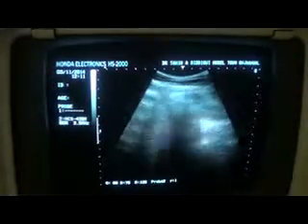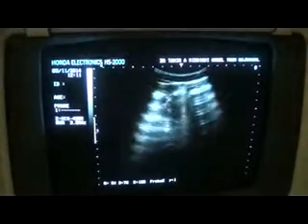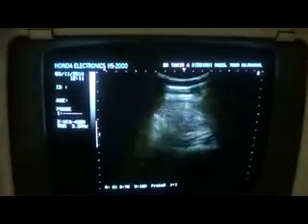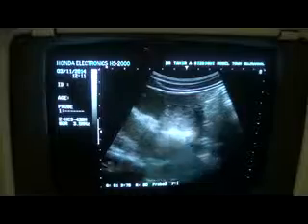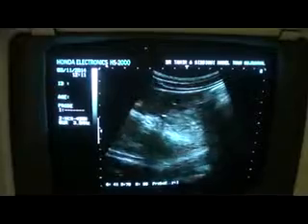On ultrasound, keeping in view the clinical picture, this is very much suggestive of peritonitis. See the respiratory movements as well. The patient is having tachypnea. Okay, now coming towards the lower abdomen, from the side of the patient, what we see is meager movement of the bowel segments in the left lower abdominal quadrant.